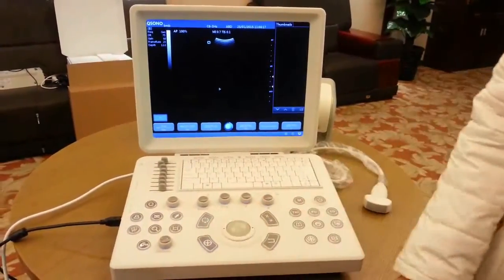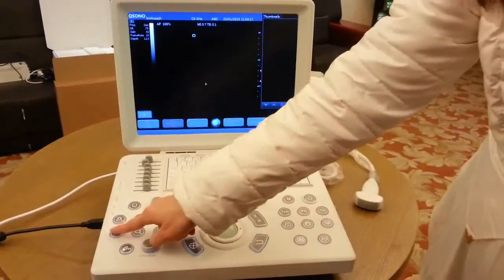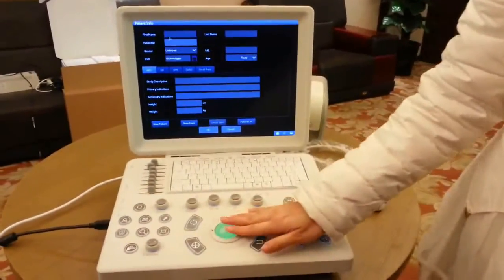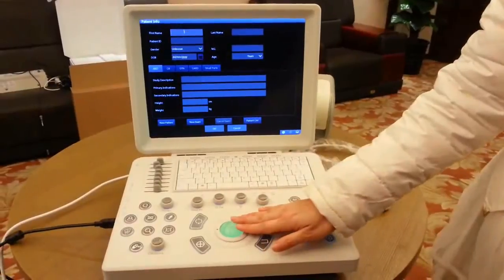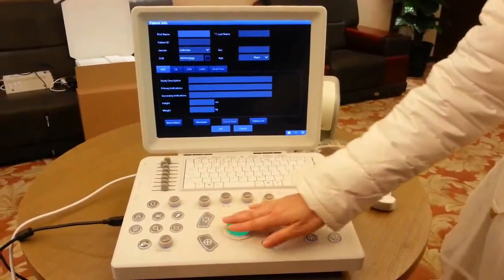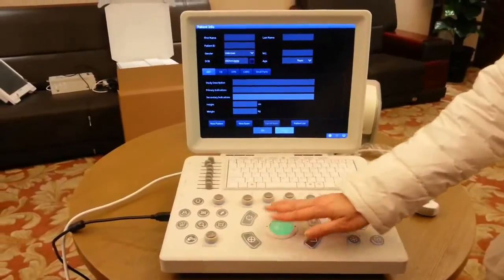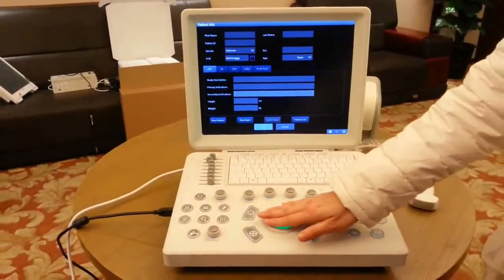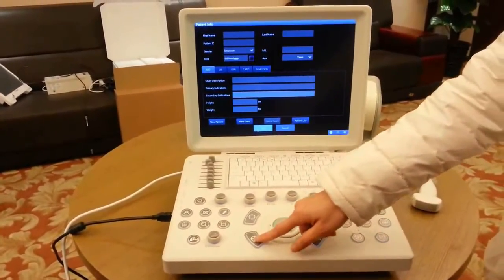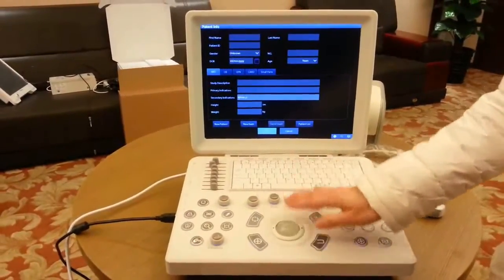To start an exam, press the patient button to enter the patient information screen. Use the trackball to move the cursor to the field where you want to input text, and use the keyboard to input. When you finish, click OK.